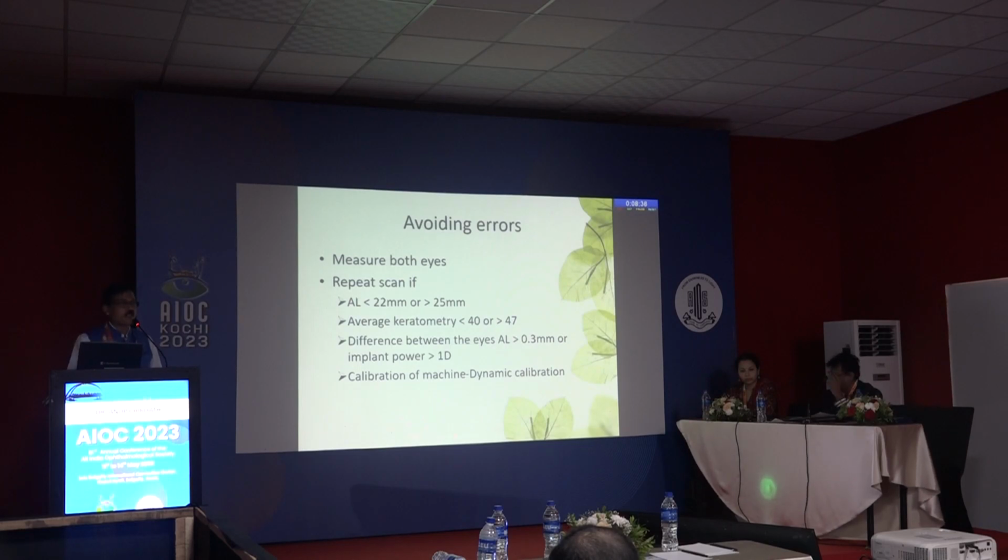In all these conditions, you have to repeat, and ideally it has to be repeated by another examiner, not by the same person.